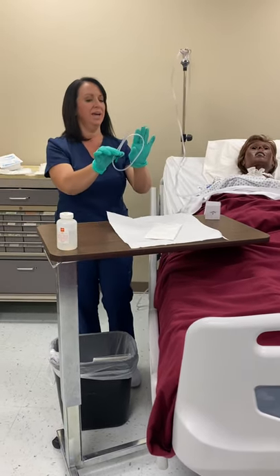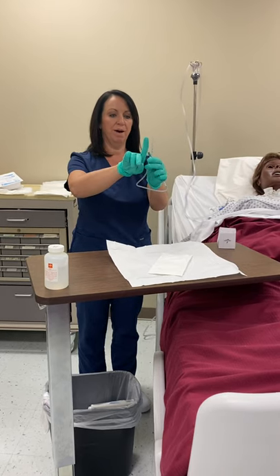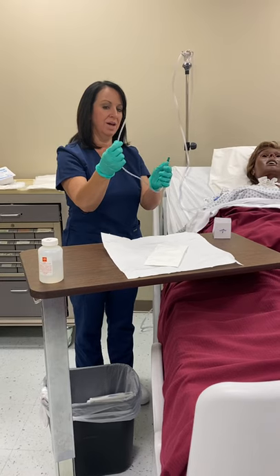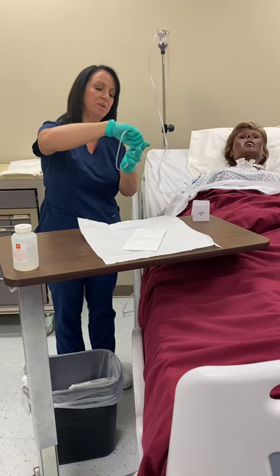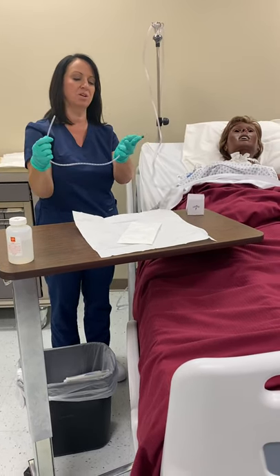Before I start with the catheter, I'm going to measure out how deep I'm going to go — about three or four inches — and I'm going to mark it with my fingers. I want to do that because I'm not going to go any deeper than that. I'm going to go straight down, and when it hits my fingers, I'll know that's as deep as I can go and I can suction on the way out.